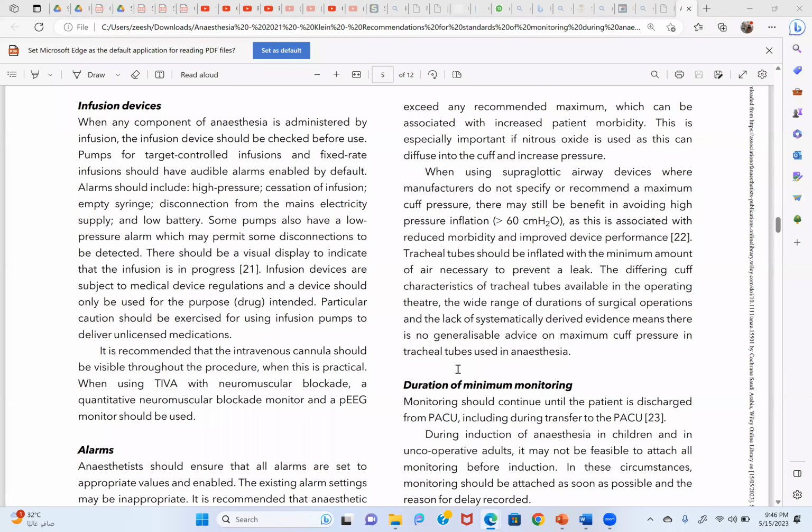I will just quickly repeat for Tayyiba. Listen, when you have low flow anesthesia, nothing is going out, everything is recirculating. So if you increase the dial concentration, because you need a specific flow to carry the gas, and the flow is very low, it will take a lot of time to reach the new equilibrium.